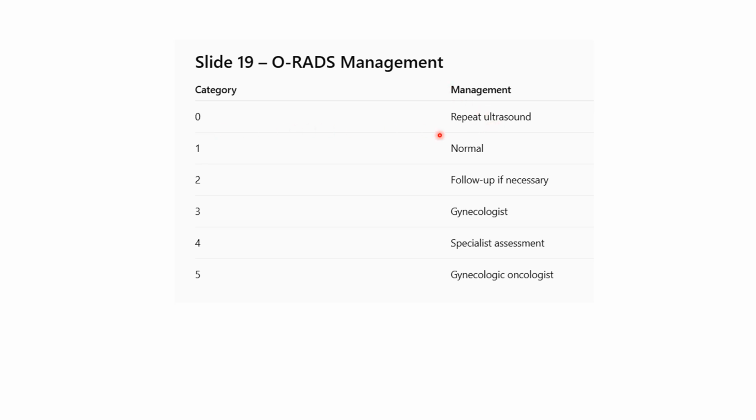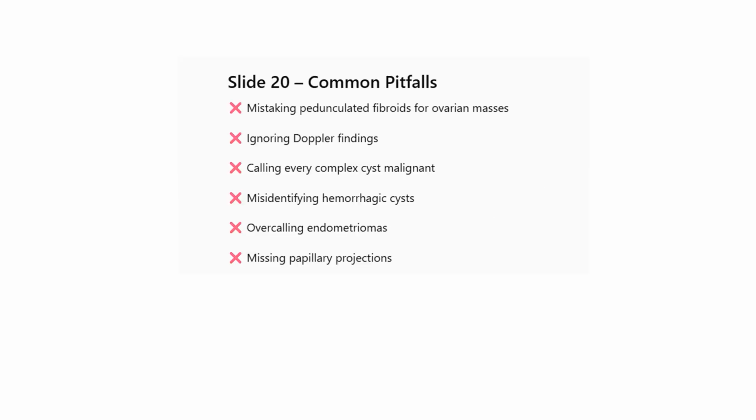Class 0, repeat ultrasound. 1, normal. 2, follow up if necessary. 3, gynecologist. 4, specialist assessment. 5, gynecologic oncologist.